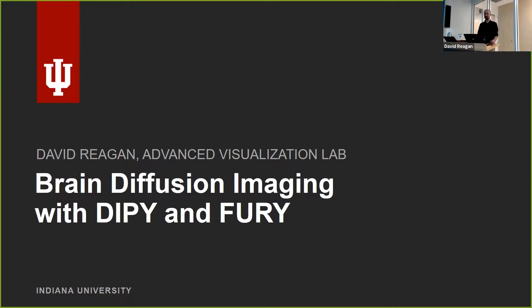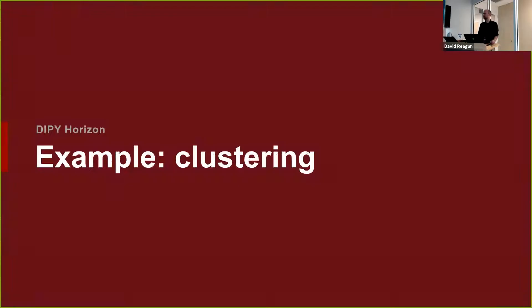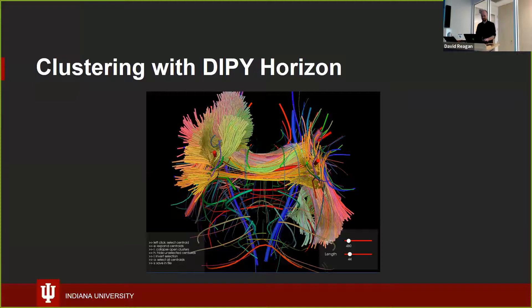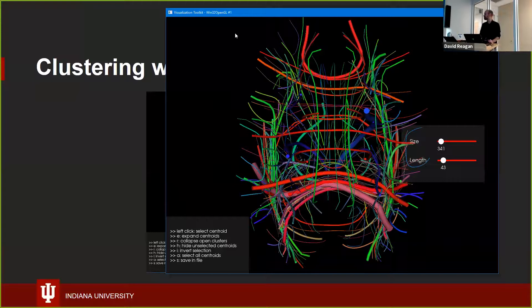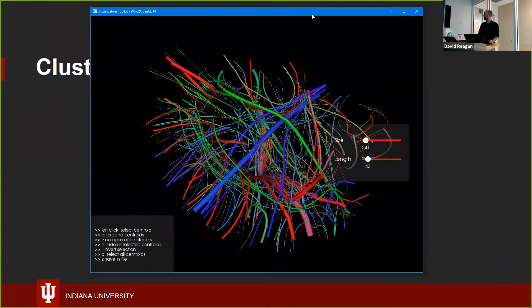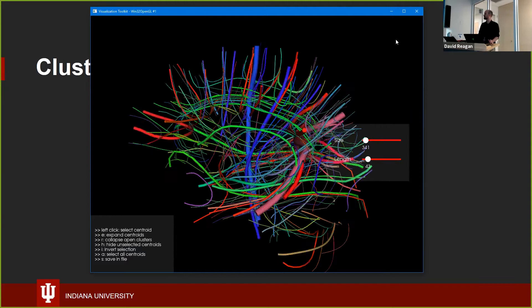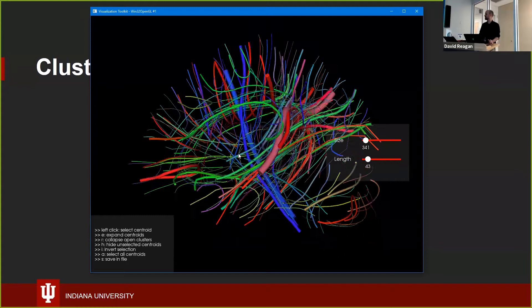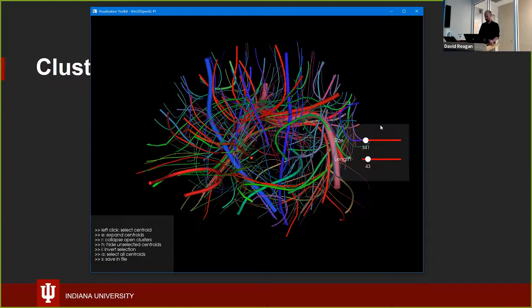The Fury part is a new addition — a special surprise for today's talk. Right off the bat I want to start by wowing you with an interactive example, then we can talk about what this is afterward. This is an interactive visualization built using DiPy and Fury. These are white matter tracks in the brain — specifically centroids of those tracks.